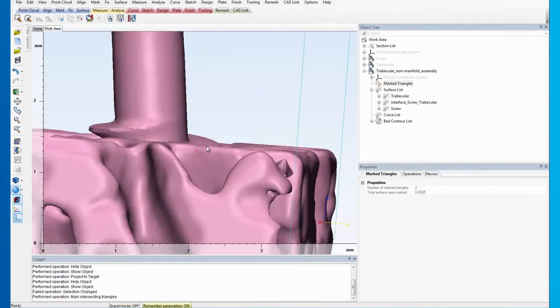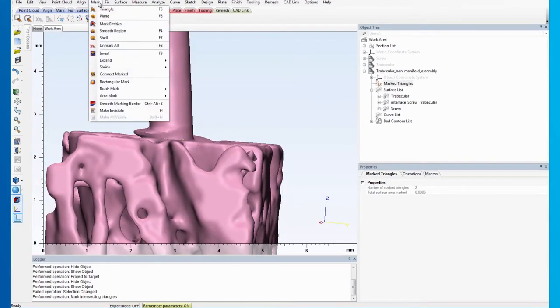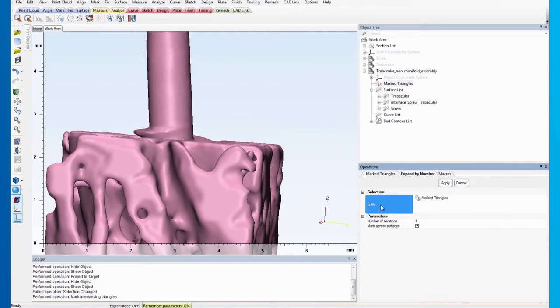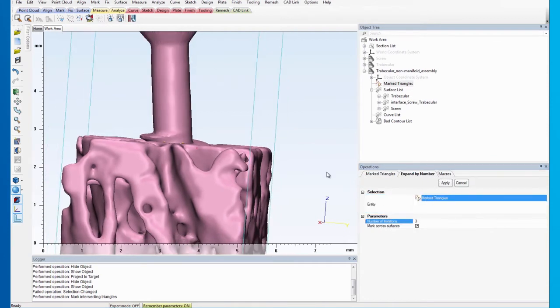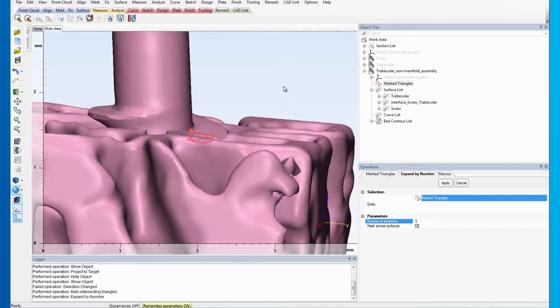To expand the marked areas, go to the Mark menu and click on Expand by Number. Select the marked triangles as the entity and set the number of iterations to 3. Click on Apply.